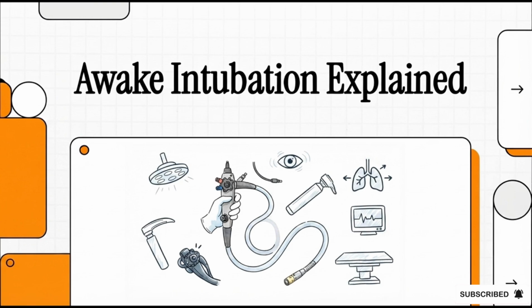For this specific patient, hitting them with general anesthesia right off the bat could instantly turn their airway into a life-threatening situation. So, instead of putting them completely to sleep, you actually have to secure their airway while they are still awake. Welcome to this explainer on awake intubation.